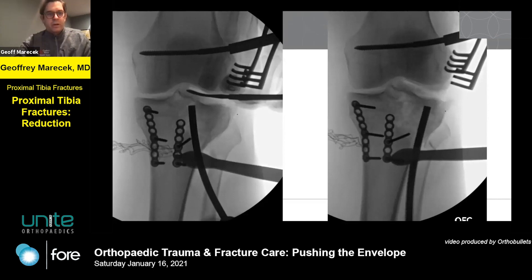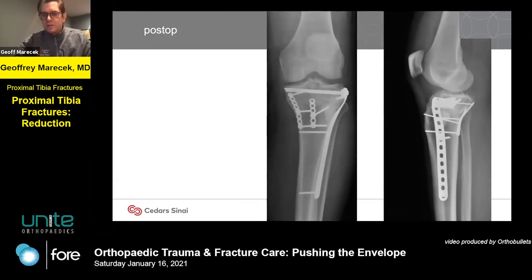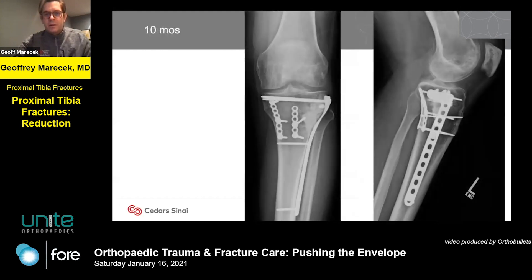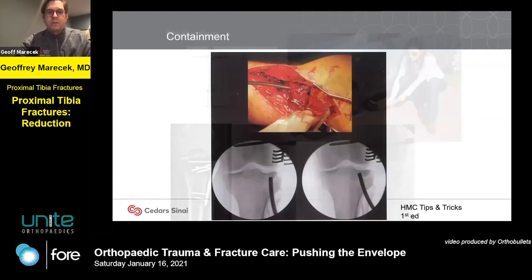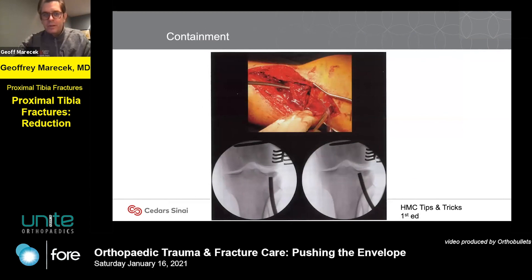We hold the reduction with Kirschner wires and then secure it with a plate and screws. Here the patient is about a year out from his injury. The two critical things here: none of us would ever change a car tire without a jack — and to me, trying to reduce articular surfaces without a distractor is the same thing. That's usually the biggest error I see when patients are sent to me for possible revision — the distractor wasn't used.